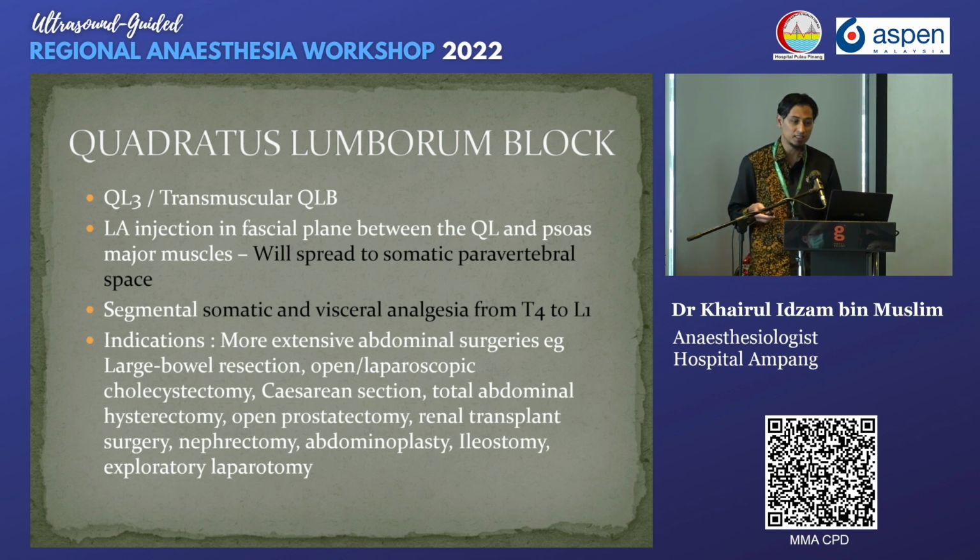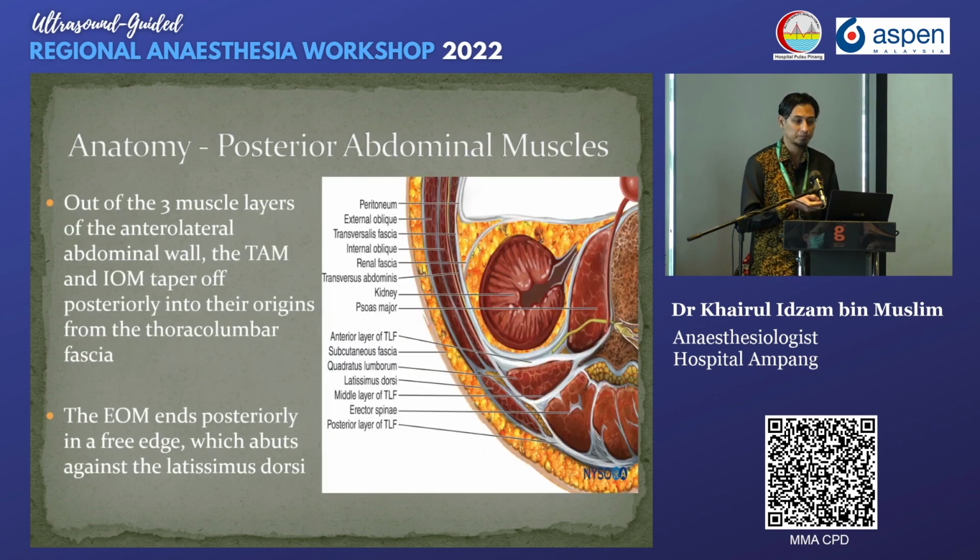So the indications: more extensive abdominal surgery such as large bowel resection, open or laparoscopic cholecystectomy, LSCS, total abdominal hysterectomy, open prostatectomy, renal transplant surgery, nephrectomy, abdominoplasty, ileostomy, and laparotomy. So the good thing about QL, it covers both somatic and visceral pain.